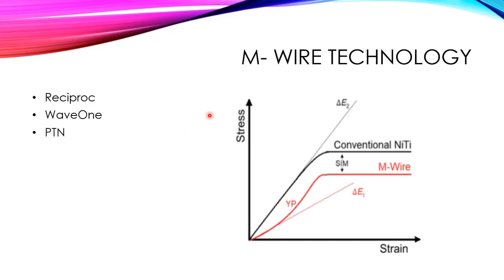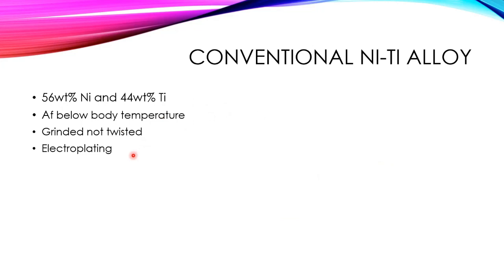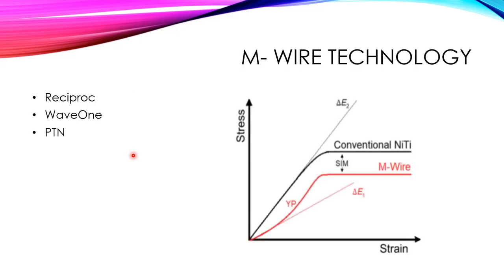There are also two schools of thought I forgot to tell you about electroplating. Some say that if a file is electroplated, there won't be any micro fractures, and there is an increase in resistance to fracture. But some studies show that electroplated files also show a fracture pattern in a zigzag track pattern. It is an SEM, scanning electron microscopic study, which shows that they show a fine irregular zigzag pattern, compared to non-polished files which show cracks along the machining grooves. It is a study done by Lopes et al. in 2010.